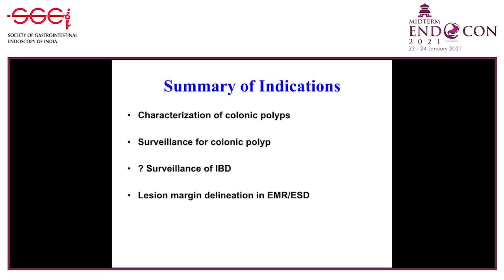So with that, I come to the end of my presentation. To summarize, narrowband imaging is a mode of image enhanced endoscopy which helps us in characterizing the lesion, predicting the underlying nature, and making therapeutic decisions.